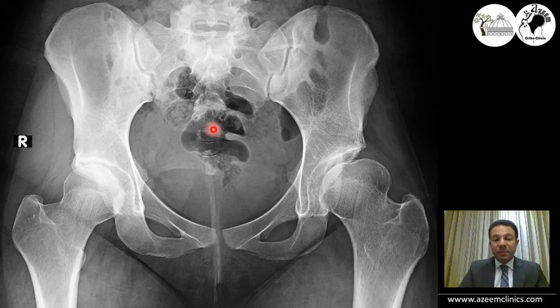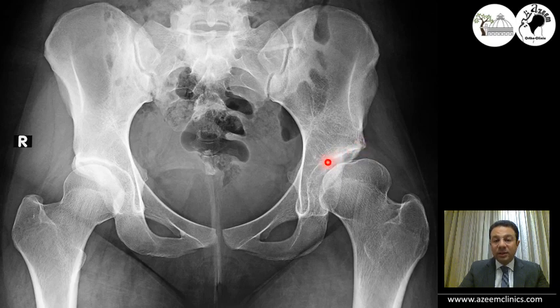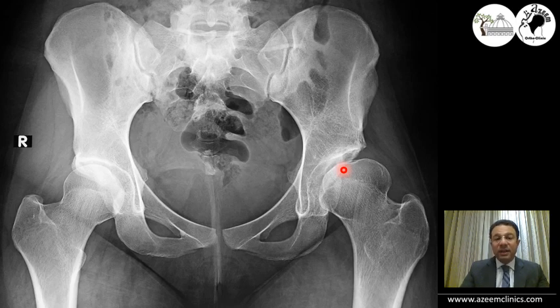This is another X-ray of another patient. If you look at the left hip, you will find that the floor is far away from the ilio-ischial line. The extrusion index is about 50% — half the head is uncovered. If we look at the dome, it's opened laterally, meaning the acetabular index angle is more than 10 degrees. Looking at the anterior and posterior wall lines, they are far medially from the center of the head, and they cross over early. That means you have a dysplastic retroverted acetabulum.